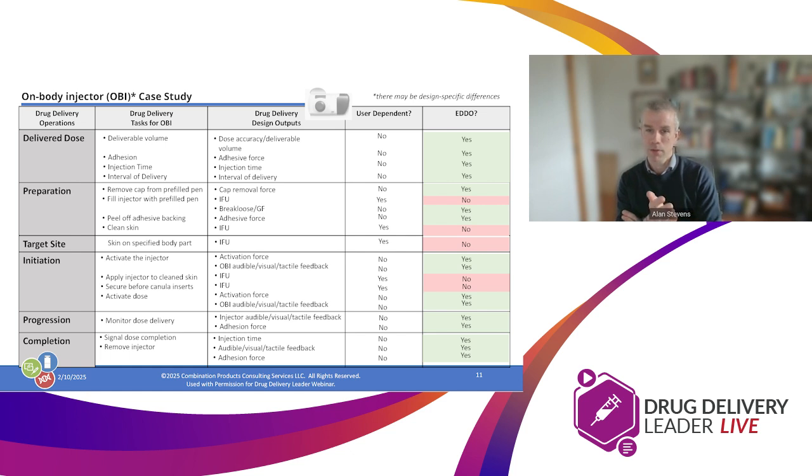So on one hand, we're looking at the consistency of the production of the product and being able to meet that force to remove the cap. And on the human factors side, are there geometrical elements or other material attributes of the device that make it easier for a patient to remove the cap? So it is definitely a human factors issue, but there's also some design and quality control elements to it as well. And so all of that matters, and the agency is looking at all of it. In terms of what we're describing here as being the EDDOs, they're looking at one specific aspect of the design, which is being controlled.